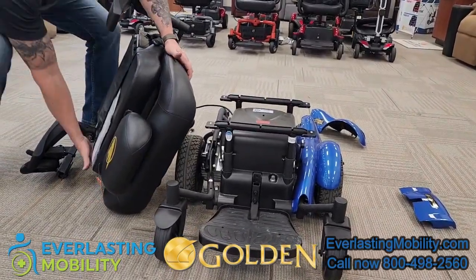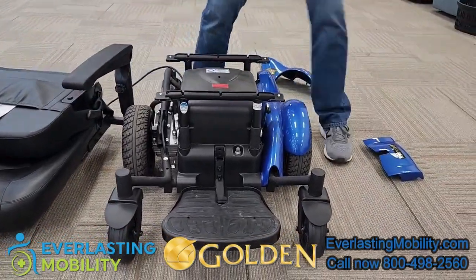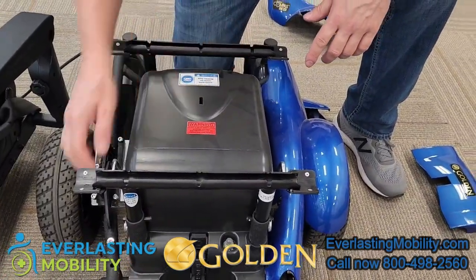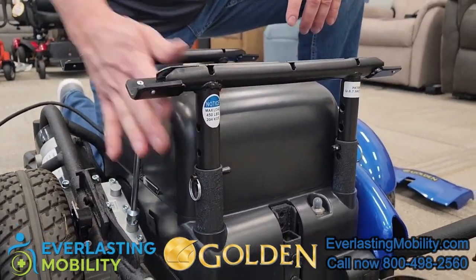When the seat is off, you can see there are two guide rails. You can drop the front in half-inch increments and you can also do it in the back as well. So you can give it a dump in the chair, or you can raise the seat height of the chair as well.